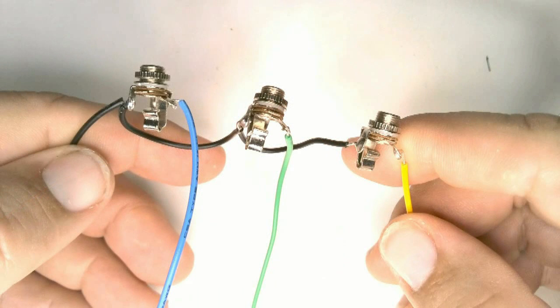Now we will put together the AT jacks. We want to create a wiring harness that looks like this. The black wire is a ground wire. It connects to the ring terminal on each of the jacks. You'll need a long black wire and 2 short black ones to connect them together. The green, blue, and yellow wires go to the tip terminals. You should use solid core wire because these wires will eventually be plugged into sockets on the TFT board.